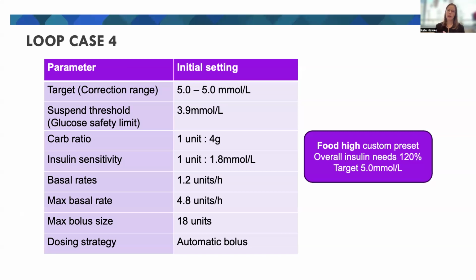If you've got any familiarity with using off-label commercial systems in pregnancy, such as Tandem Control IQ or Medtronic 780G, clinicians who use those will talk about doing fake carb entries and other strategies to supplement the automated insulin delivery, which persists with background insulin delivery after a meal bolus. When automated systems are not truly optimized for pregnancy, they can have a tendency to lower basal or switch off basal post-meal because there's a high insulin on board from that big carb entry. That's really unhelpful in pregnancy, to have the system backing off post-meal.